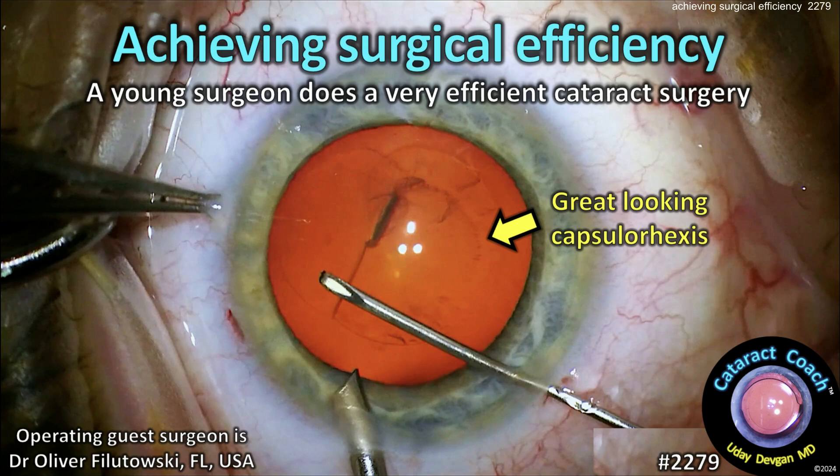CataractCoach.com — achieving surgical efficiency. A young surgeon here does a very efficient cataract surgery. Let's watch.